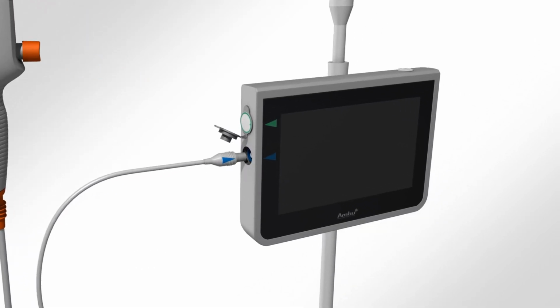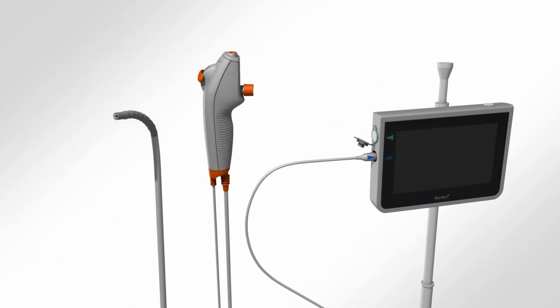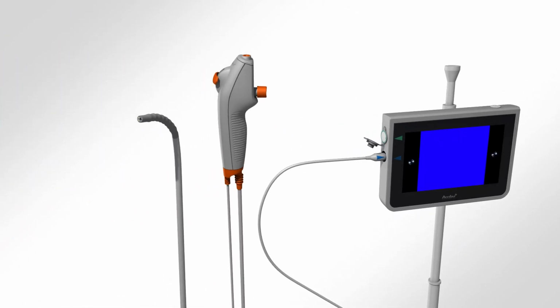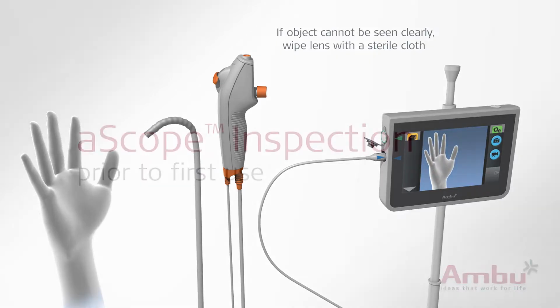Connect the aScope to the aView by plugging the white male connector with a blue arrow into the corresponding blue female connector on the aView. Press the power button on the top of the aView once. Verify that a live video image appears on the screen by focusing the distal end of the aScope towards an object.